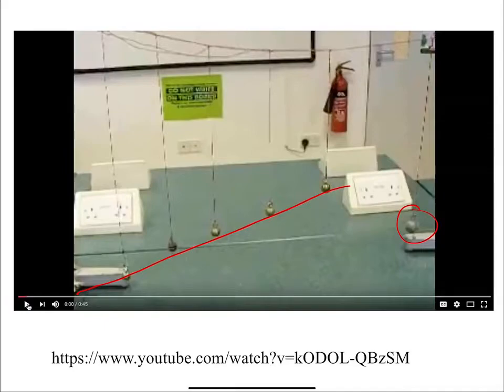Okay. The problem with that is it can only excite spins in one location effectively. But what we want to do is excite spins in a slice, and we want to be able to designate how thick that slice is. You might want to say, I want a 2 millimeter thick slice, and the next day you say, I want a 4 millimeter thick slice. So we want to be able to control the slice thickness and not just be limited to exciting a single plane of spins. So we're going to talk about how we would do that.